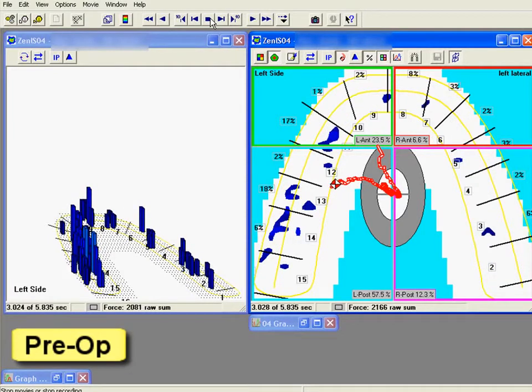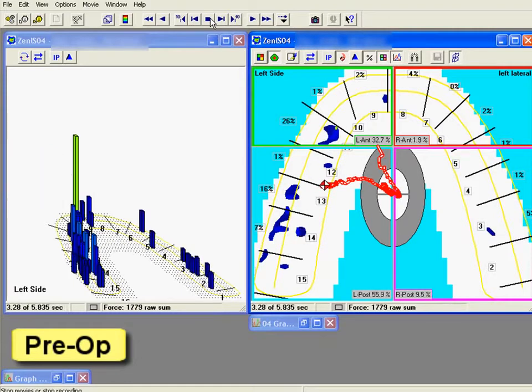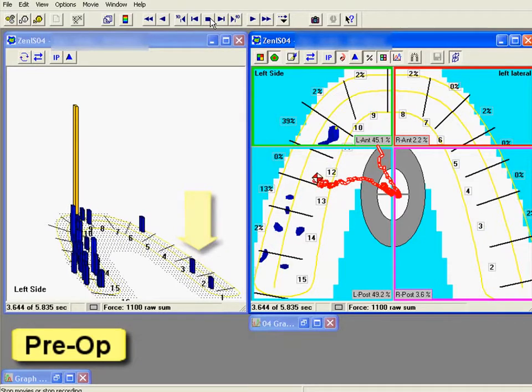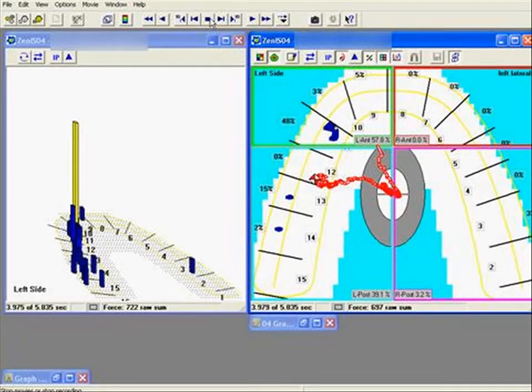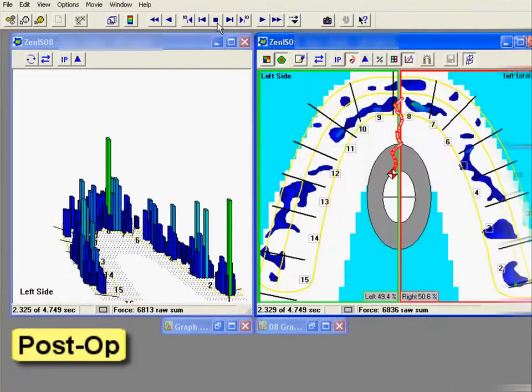Once the patient has reached anterior guidance, you can see that tooth number 11 is in contact. However, there is still posterior teeth active on the working side and contact on tooth number 2 on the non-working side. As the non-working side finally discludes, there is still active contact on the working side. It takes the patient 2.532 seconds into the excursion to reach true anterior guidance.